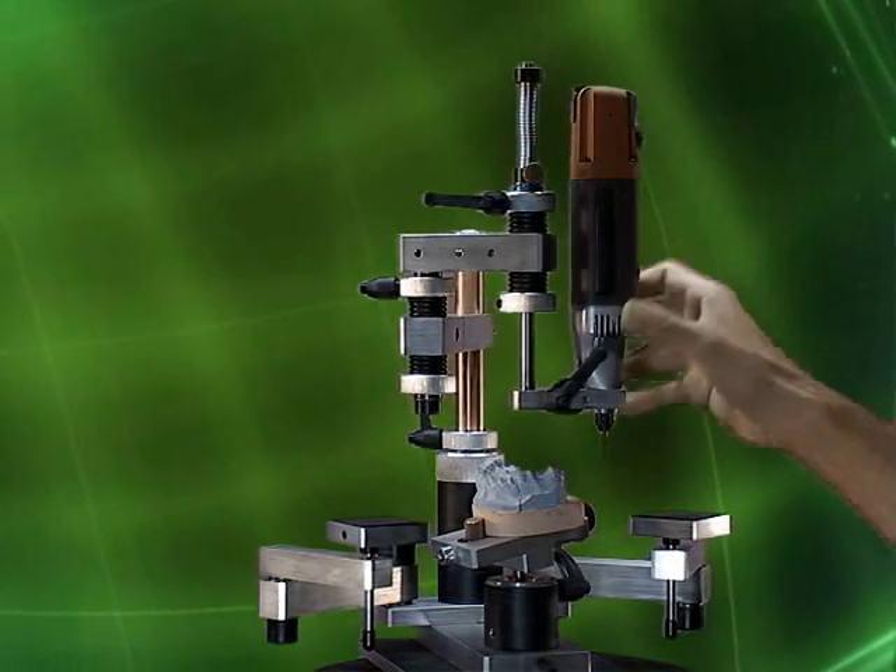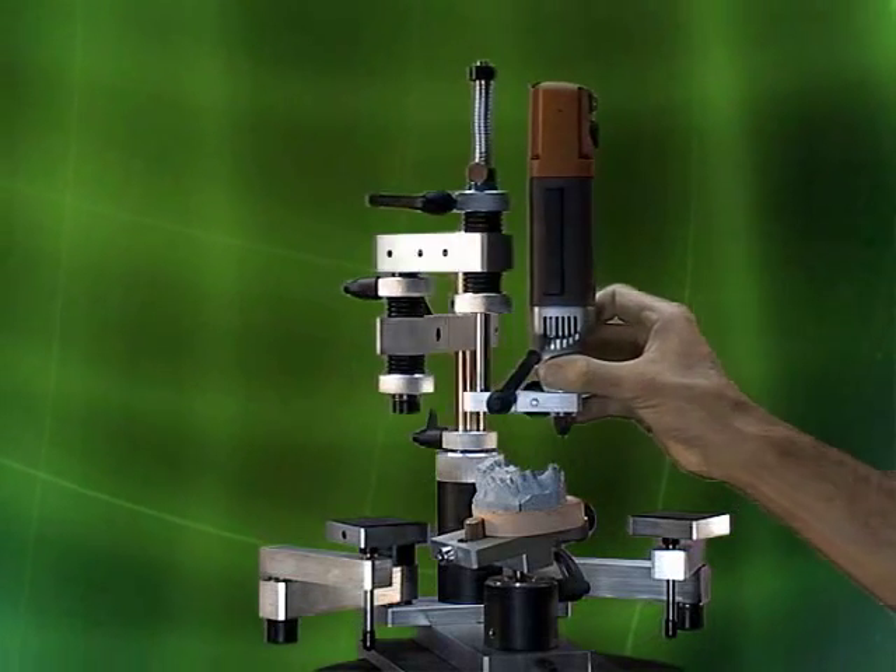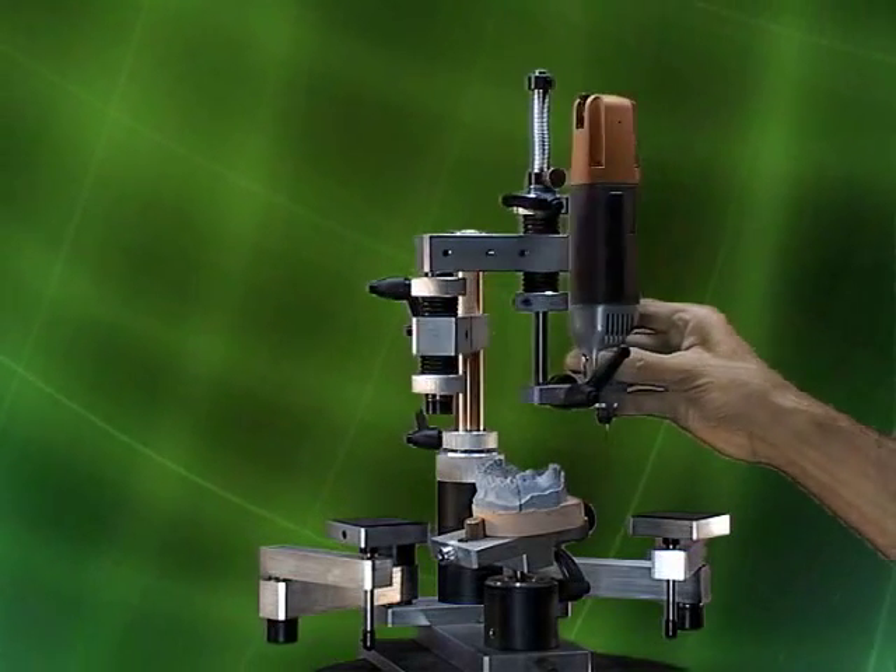A good example would be milling a lingual shelf. You don't want the height to vary from the mesial to the distal.